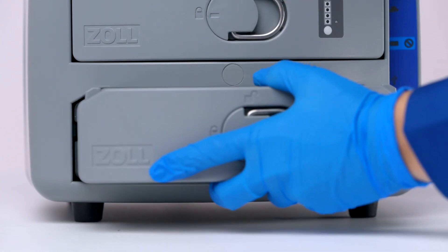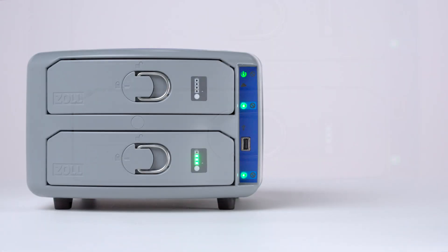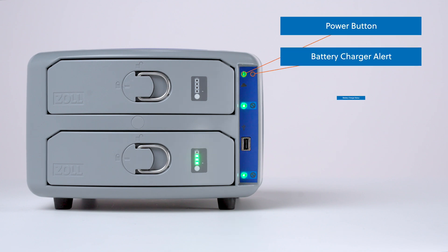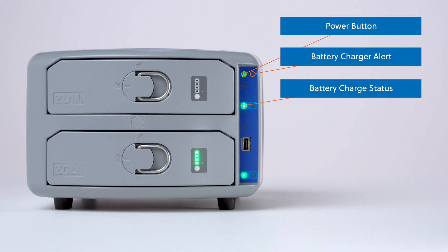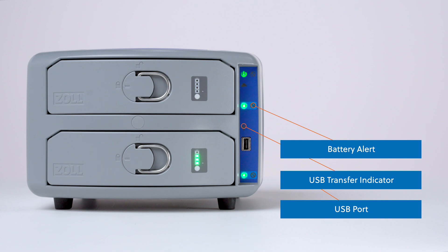The battery charger should automatically detect the battery and start the charge cycle. On the front of the battery charger is the blue control panel. The control panel contains a power button, the battery charger alert, the battery charge status indicator, the battery alert indicator, a USB transfer indicator, and a USB port.